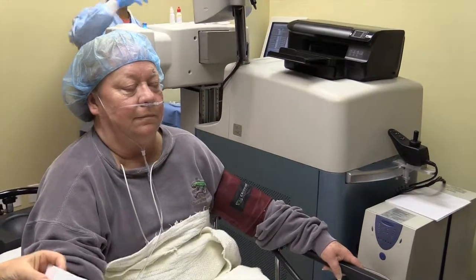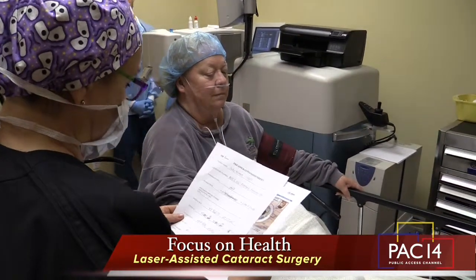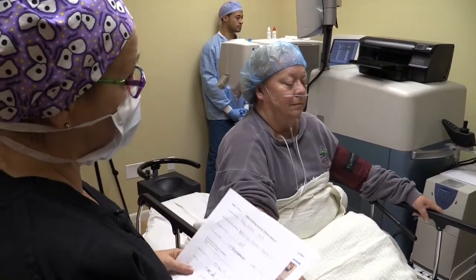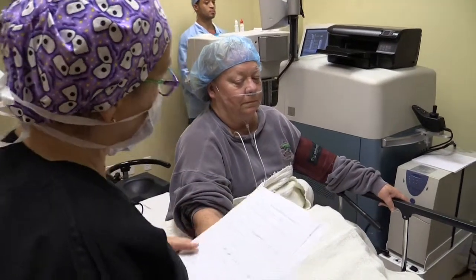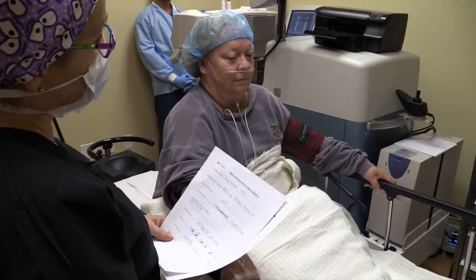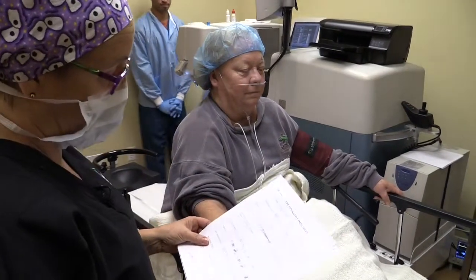Probably the hardest part about this surgery is what we call the surgical planning. And there's a lot that goes into surgical planning, all kinds of tests in terms of the shape of the cornea. We'll take a look at that a little later. We have tests then that measure the amount of astigmatism that's there, and from there we decide which implant she is going to qualify for. Ms. Brown has chosen to have a Restor multifocal lens that will allow her to see distance and near. Now, she has a little bit of astigmatism left. We will be able to correct that with this new technology femto laser to try and give her best possible vision for distance and near.